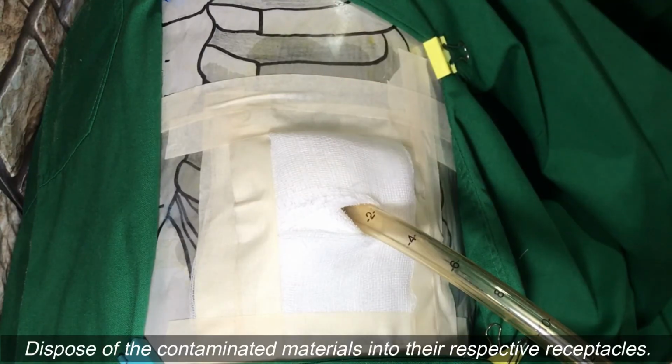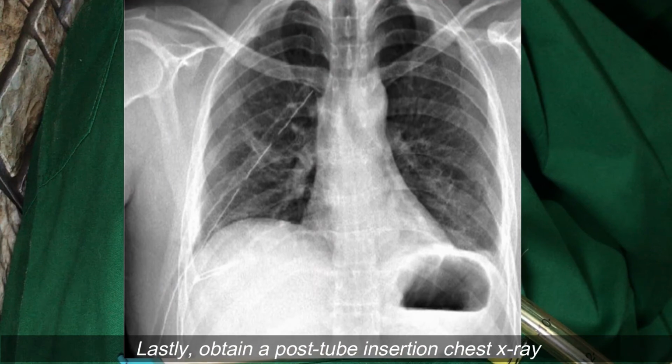Dispose of contaminated materials into their respective receptacles. Lastly, obtain a post-tube insertion chest X-ray to check the position of the tube.